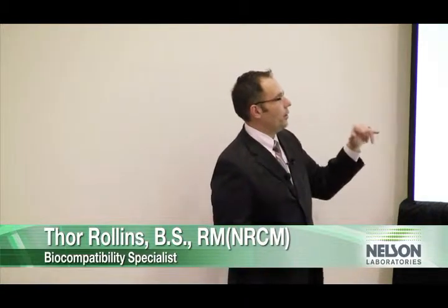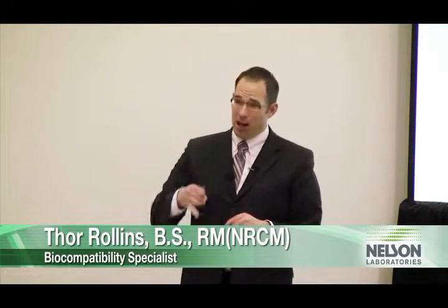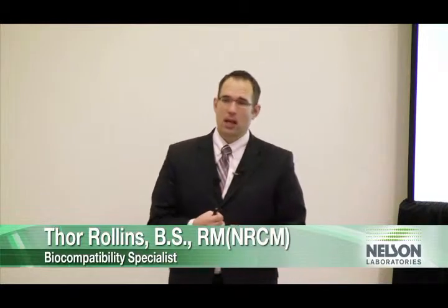So kind of the quick sum up on the changes, the -4, the new chart, okay, that's going to be looking on surface area, and hopefully be able to have good guidance on what testing you need to do for your device. Molly Gosh from the FDA is on that committee with me. So she is doing some great input on there, and so we're hoping that the end goal of -4 is to have full acceptance by FDA, Europe, and Japan.